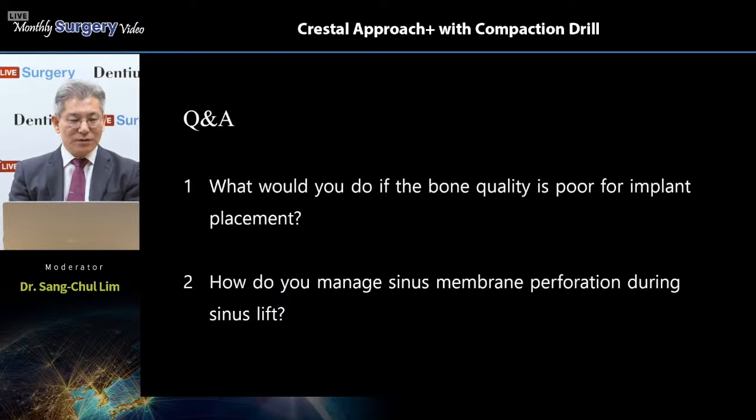The second question is here. How do you manage sinus membrane perforation during sinus lift? Very nice and general question about the sinus elevation procedure. Actually, we have to divide the lateral approach case and the crestal approach case. The first, the crestal approach case. In the crestal approach case, the perforation is very difficult to overcome, actually.